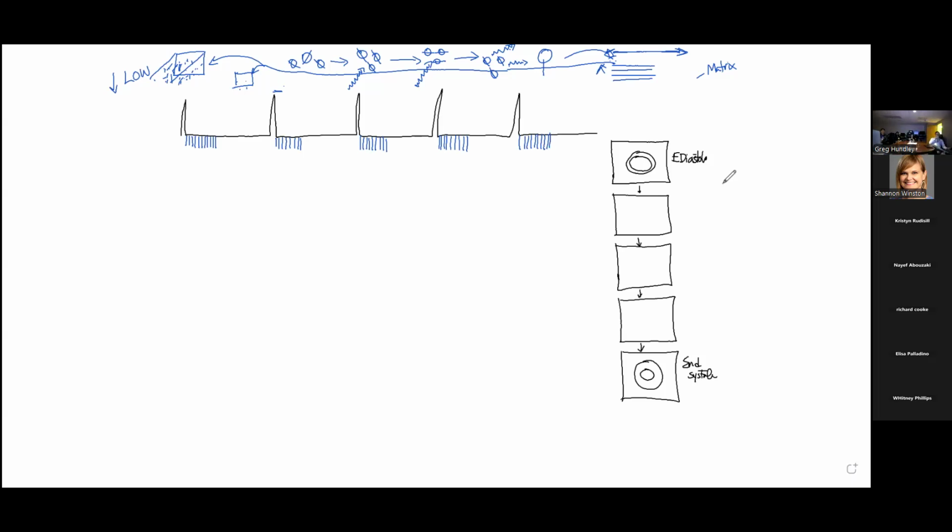You'll hear in MR, last week or 2 weeks ago, we talked about T1 and T2. You'll hear about another two paired series of terms called repetition time, or TR, and TE. And so the way we make this movie is we are going to gather information at points in time relative to this constant trigger that we see. So you see me make these little marks up above these QRS complexes.